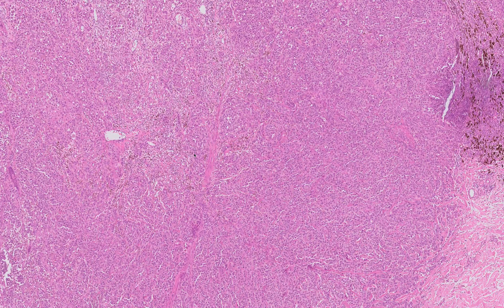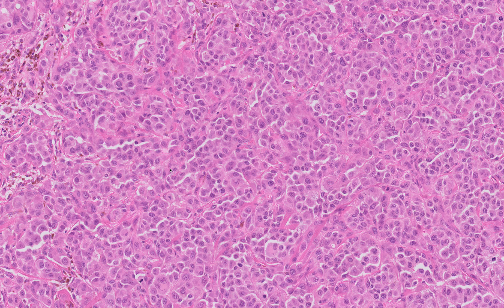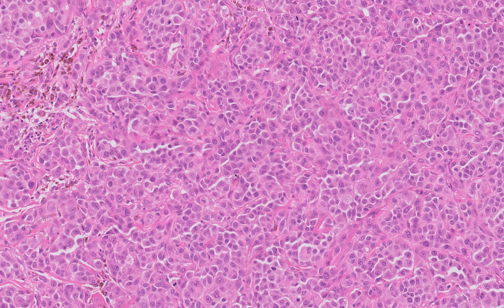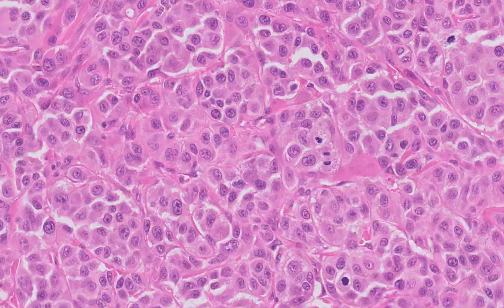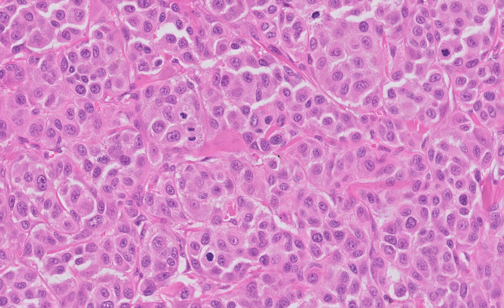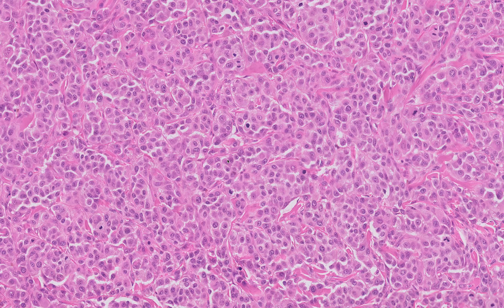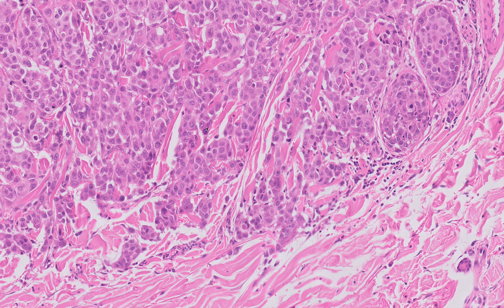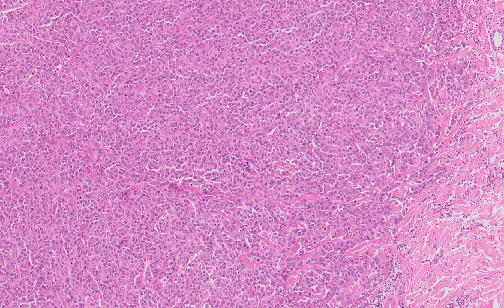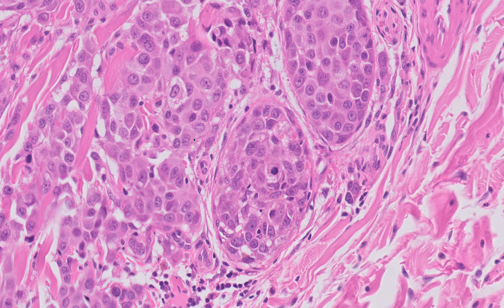Looking closer, the tumour is made up of large pleomorphic cells that look melanocytic and are associated with melanin pigment. There is fairly readily identifiable mitotic activity, and a complete lack of any maturation effect — cells right at the base of the tumour look similar to those at the top, with mitotic activity still evident right down at the base.